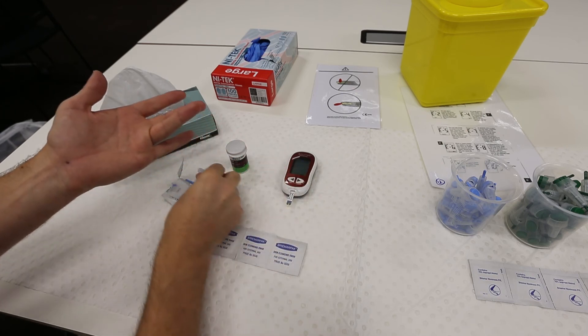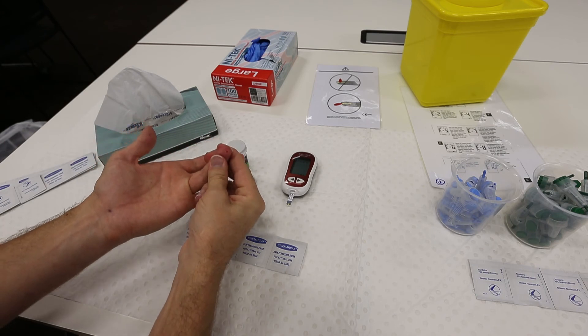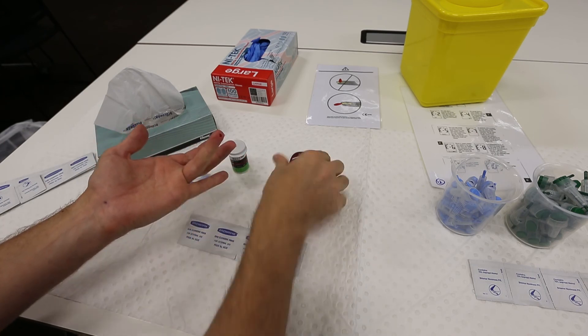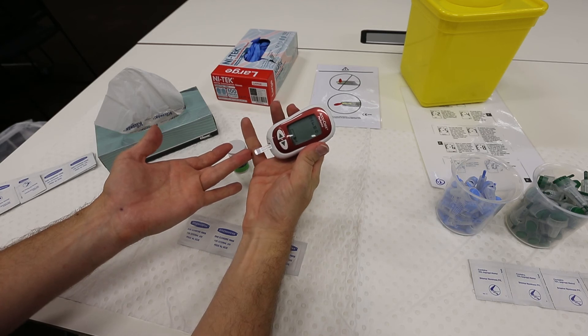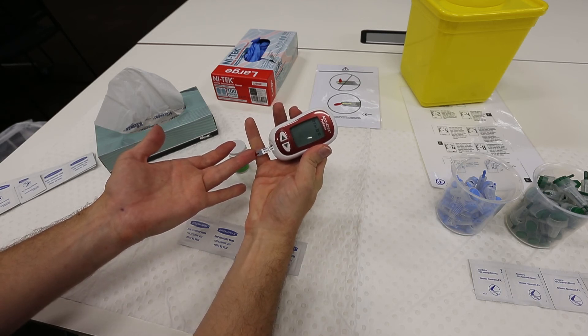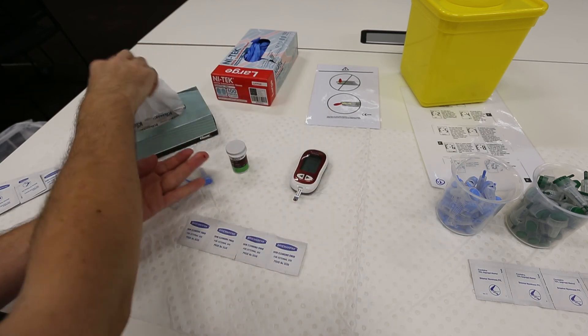You can put the lancet on the table and gently squeeze your finger to encourage a drop of blood to the surface. Next, pick up the glucose test meter and sample your blood as demonstrated earlier.